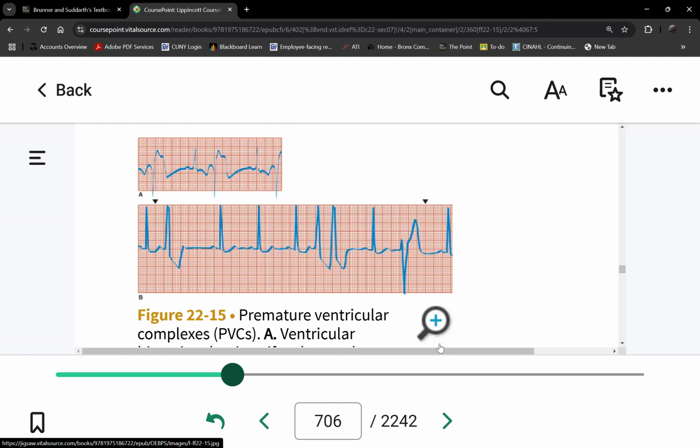VTAC, ventricular tachycardia. There's no like 10-tuplets, if there's such a word, or quintuplets. There's nothing like that. So if it's more than four, meaning five or more, that's ventricular tachycardia already.